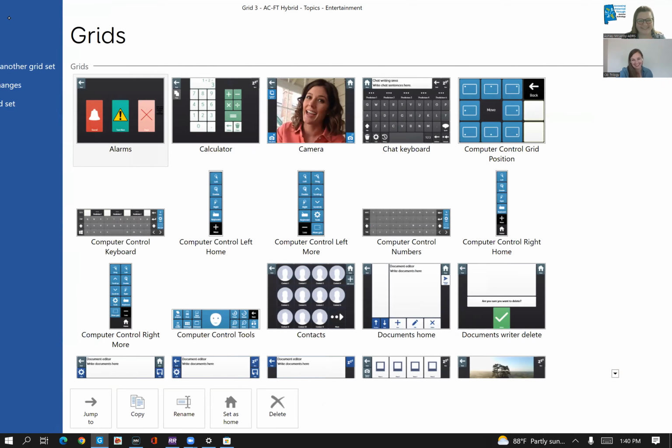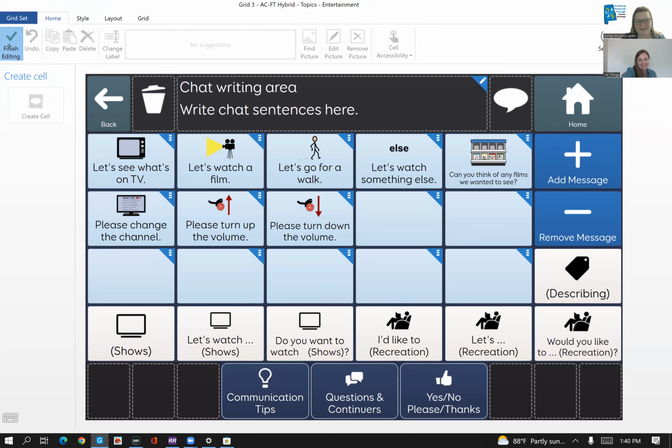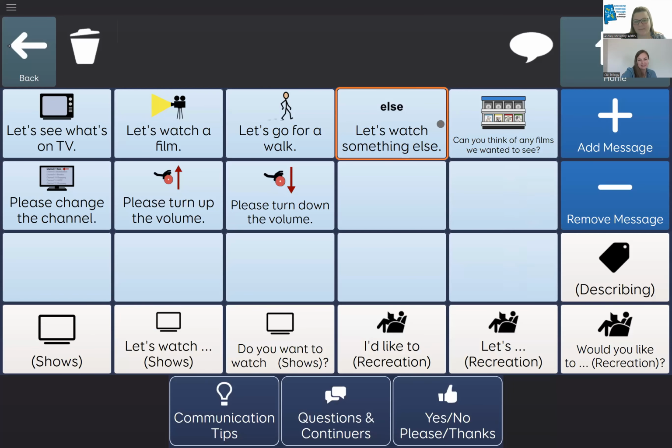Right. Long story short, there's millions of ways to do what you're wanting to do. And particularly with Alexa, it's easy to set up either in somebody's communication board or on the Alexa page or through environmental control, whatever. It's easy to do, but they're going to need that system set up through your smart device first. So you would have to set it up through the Alexa app, make sure all your devices are connected, and then you're just using the communication device to say the phrase.